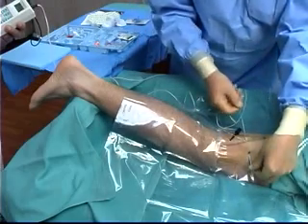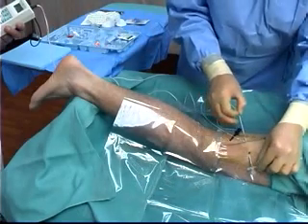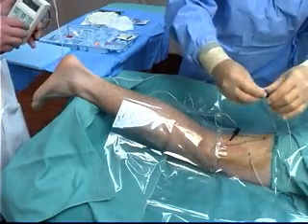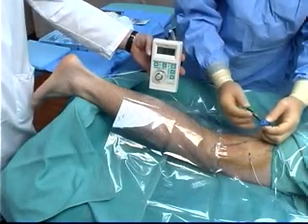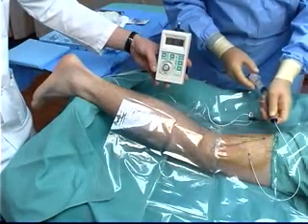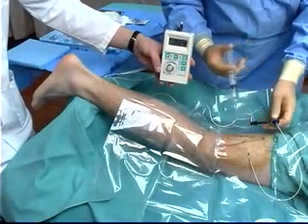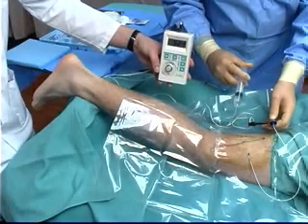The needle is removed and the piece of silicone protection of the tip of the catheter during packaging is handy to protect the skin under the skin bridge. The snap lock is attached to the proximal end of the catheter and the nerve stimulator is attached to the snap lock. The motor response should remain unchanged. The nerve stimulator output is set to 0 and slowly turned up until the muscle twitches can just be seen. The local anesthetic agent or any other fluid that conducts electricity is injected through the catheter.